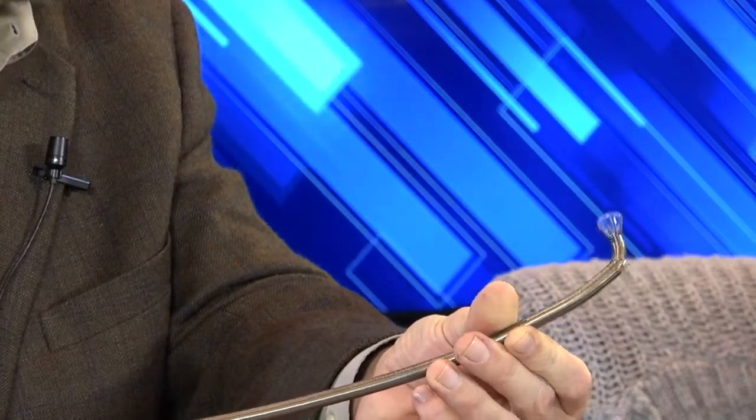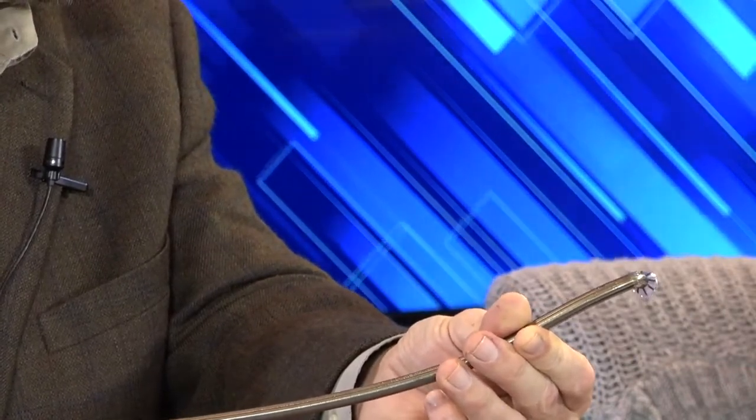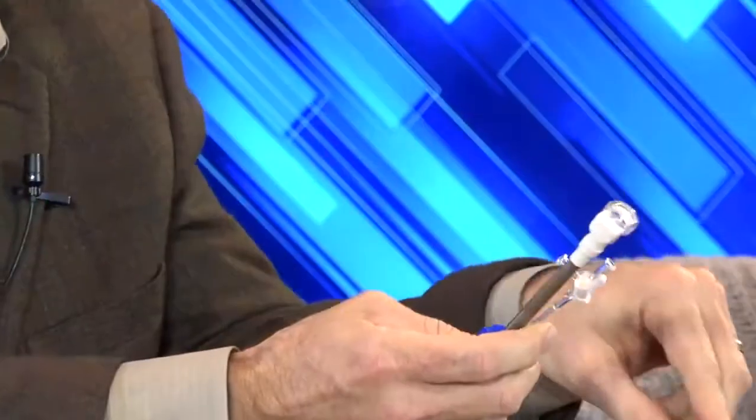Very nice, very nice. You mind if I ask what the stopcock's for? The stopcock on the back end here is a flush port. It's a great question, by the way. Now that we have an oversheath as opposed to a balloon, I'll go ahead and separate the whole thing out. You wouldn't normally do this, but I'll just separate them out so that you can see that you have two completely separate tubes here. Now I see.